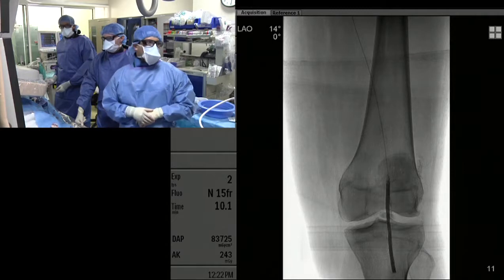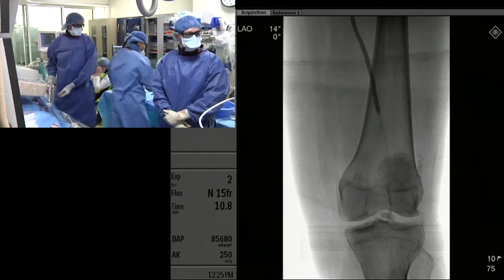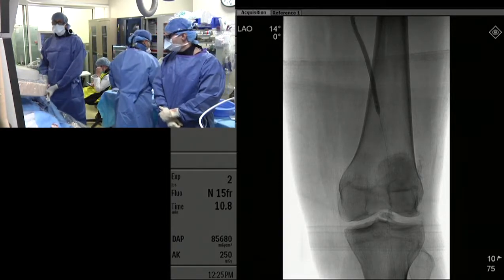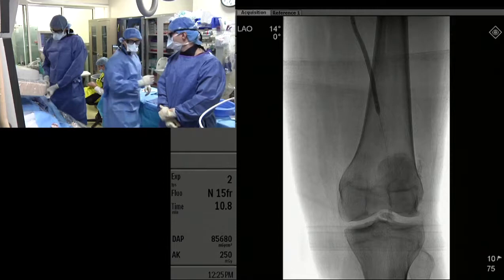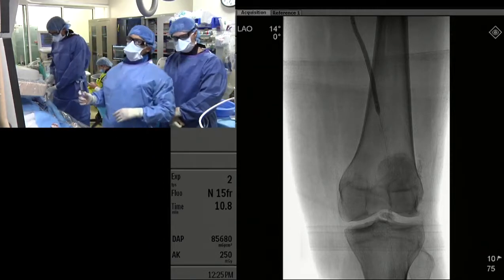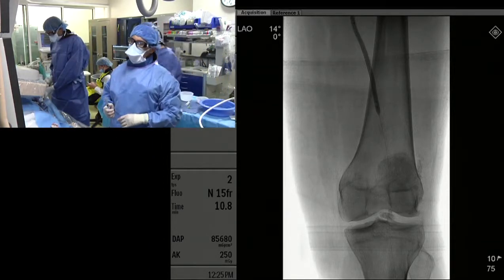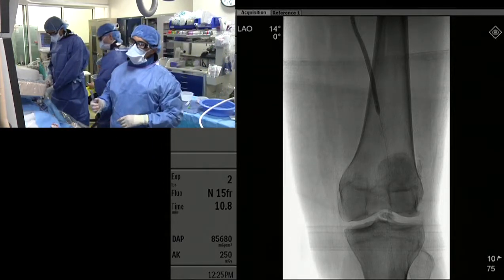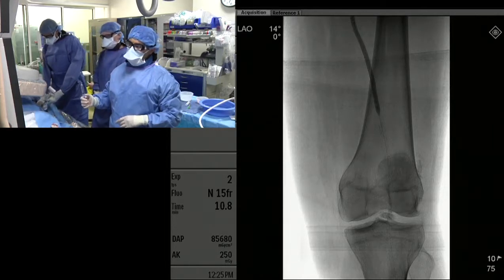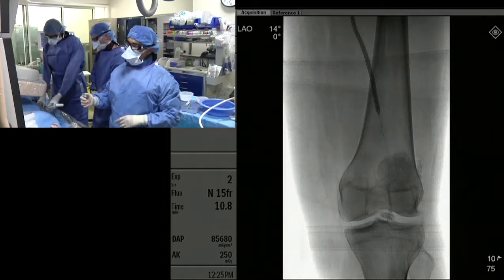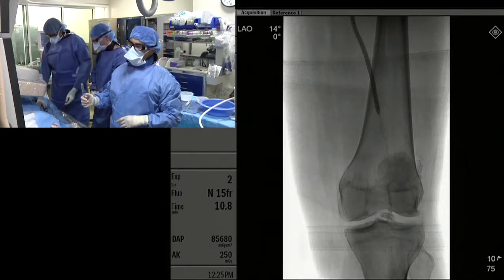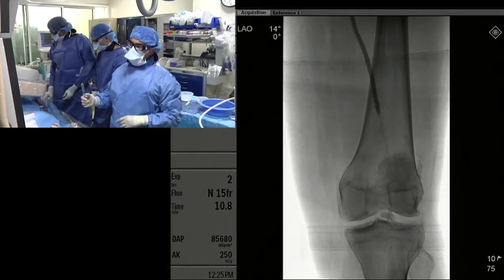What are your options for bailout stenting? When we started the procedure, we used a 150-length catheter to get down into this segment, and that 150-length catheter actually gets us beyond these lesions.